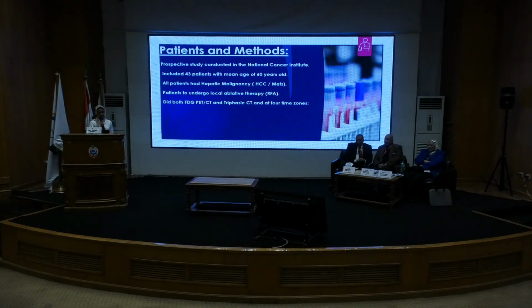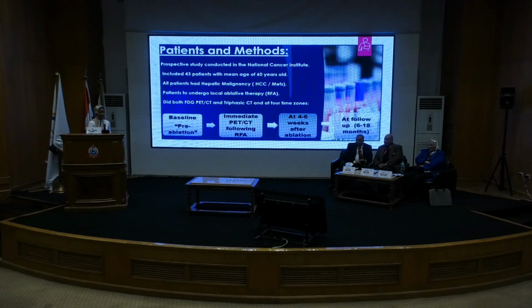Our study was a prospective study conducted in the NCI, which included 43 patients with a mean age of 60 years old. All patients had hepatic malignancy, underwent RFA, and did both FDG PET-CT and triphasic CT at 4 time zones: baseline pre-ablation scan, immediate PET-CT following the RFA, at 4 to 6 weeks after ablation, and then follow-up scans done over a median of 6 to 18 months.